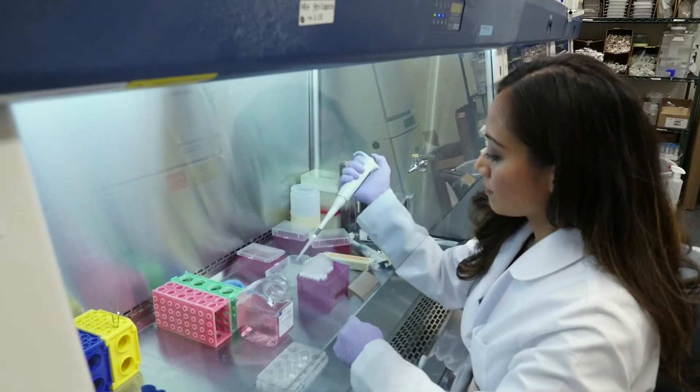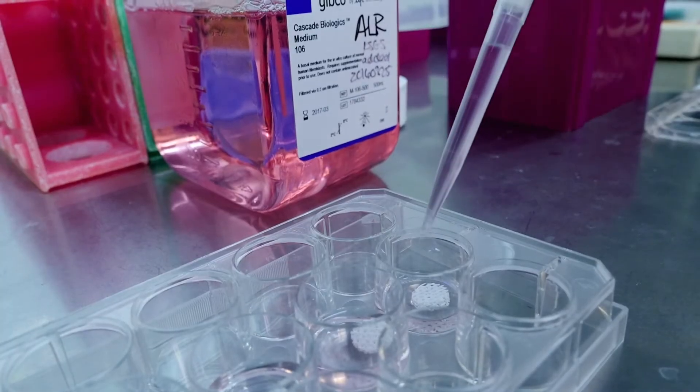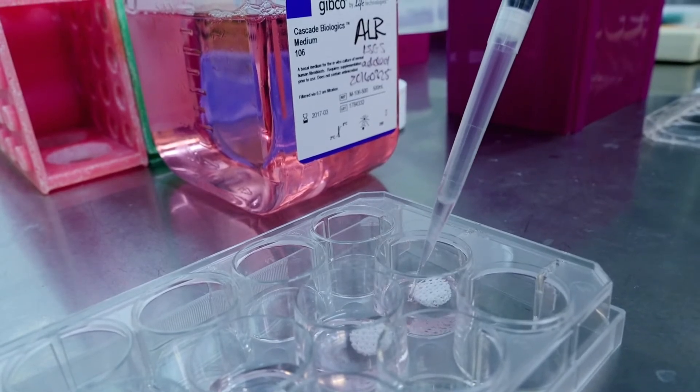Once implanted, the hyperelastic bone promotes tissue growth and becomes part of the patient's own bone as it regenerates. So once implanted inside the body, the hyperelastic bone eventually becomes new bone — it becomes part of you.